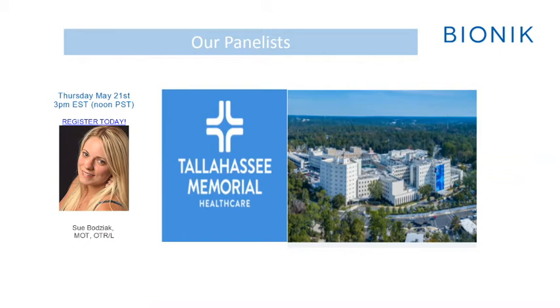Because a lot of times with stroke in particular, people don't think that their arm is moving because it doesn't move against gravity. Well, if you take gravity out of the picture, they actually start to see that they have a lot more movement than they thought. And so by doing that, we give the person some success. And then we challenge them. And we can challenge them in two different ways. We can either change the size of the circle to the larger one, or we can even set it up so that you're only doing the northern hemisphere. And the person is actually only doing motions into that outer range of motion.